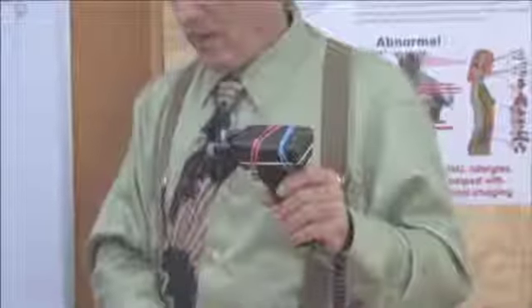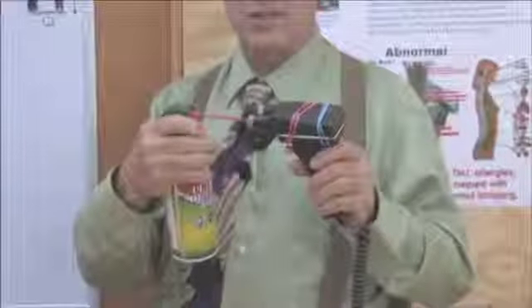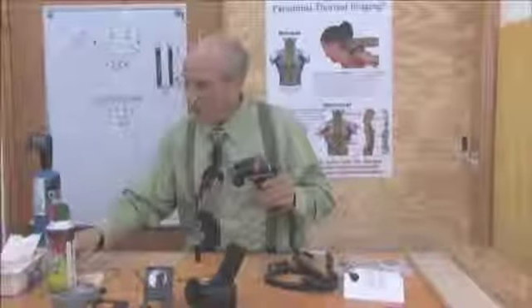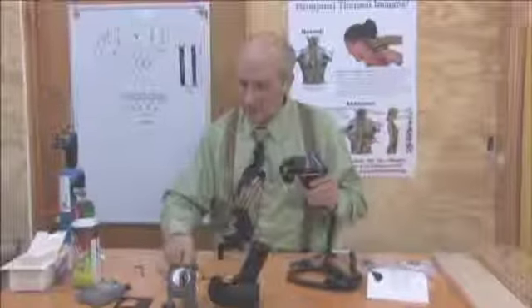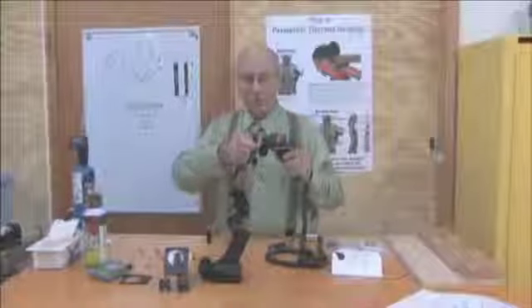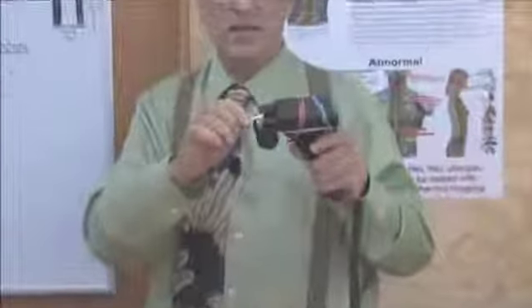Everything is out, out, out. Get it out. And then you can go down, and it doesn't hurt to almost touch the lens, and give a shot. And that will blow out any debris. Now, after doing that, you'll also notice I have a little cup of water here and a wet sponge. No alcohol, just water. And I will clean by going in a rotary motion. I will clean any dead skin or flakes that may have formed inside the clear barrels. The tips, just the tips.